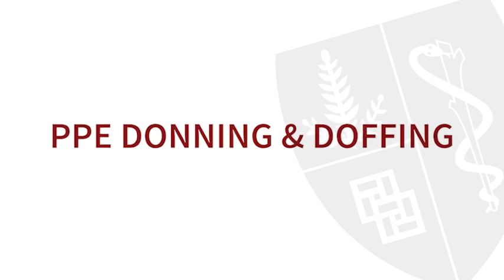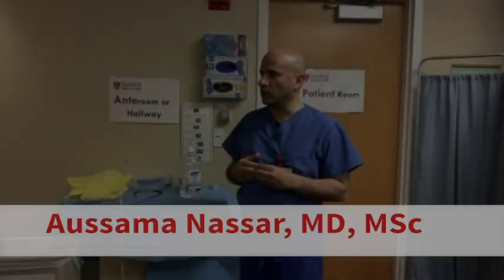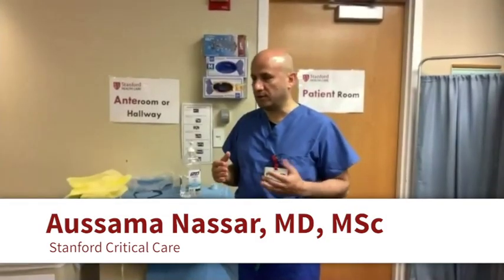Hi everyone. We're going to demonstrate the CDC guidelines on how to don and doff. We'll start with the first step. Dr. Knowlton, you're on.